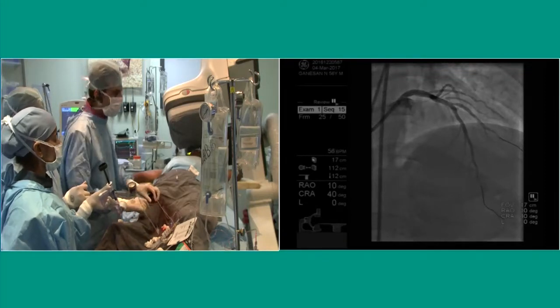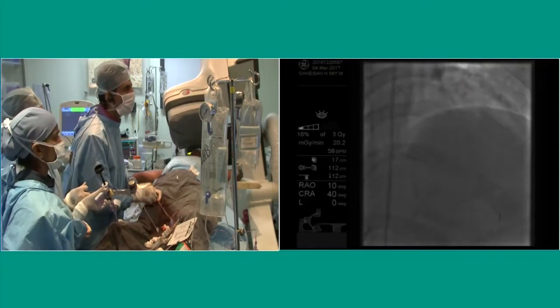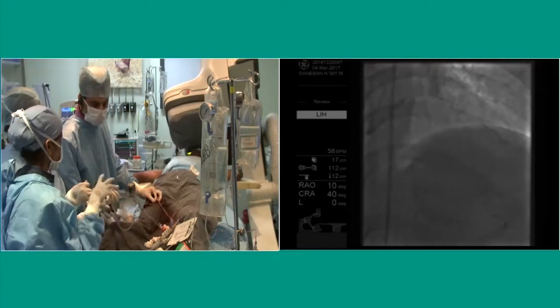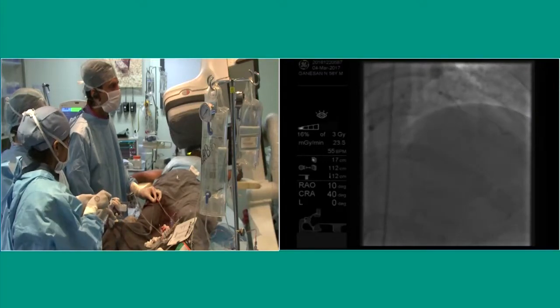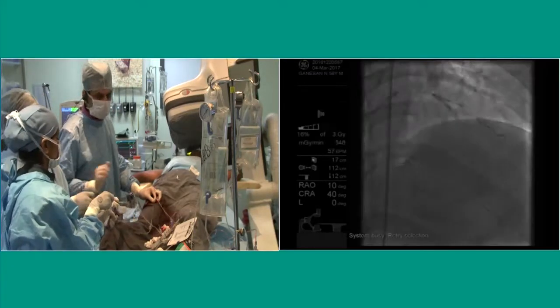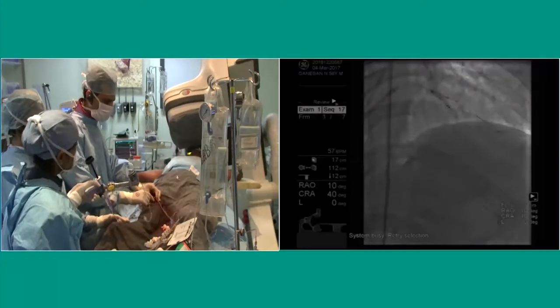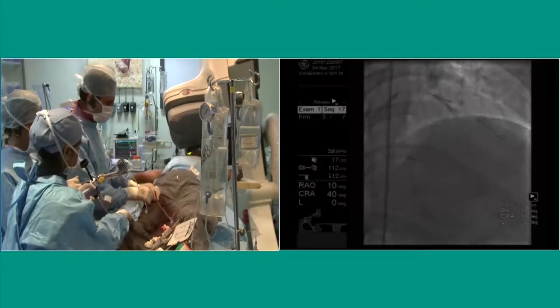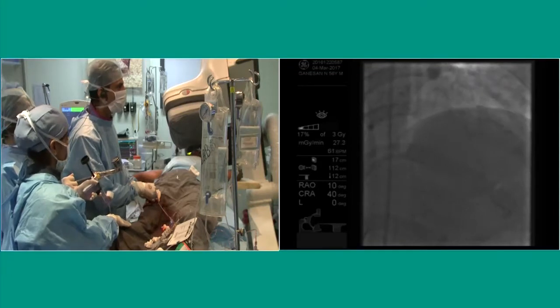Did you do an OCT now to see the ostium of the diagonal? No, we didn't do OCT before the kissing balloon. As you mentioned, you would prefer to avoid having to stent the diagonal. Therefore, the size of the balloon for the diagonal kissing procedure is important. You don't want to oversize it, to avoid dissection that would force you to stent it. Absolutely. So you've used a 2.0 in the diagonal? Absolutely, I did use a 2.0 just to avoid any pinching.